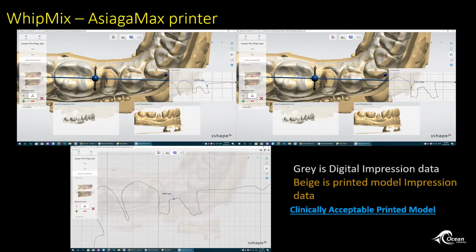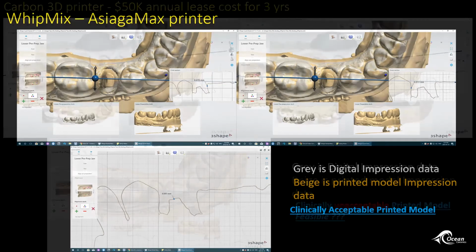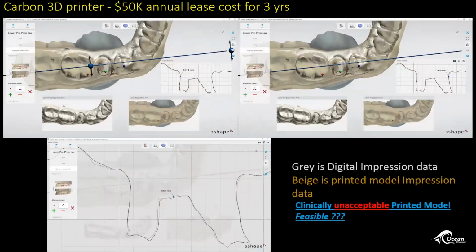So I sent one off to Whip Mix and they sent back a very decent model. This contact was 19 microns accurate, and there's that 13 microns there. The prep was decent. It was a great model. I had no complaints there at all, and I've heard good things about their printer systems. But my gut feeling said I didn't want to invest in it. Don't know why.